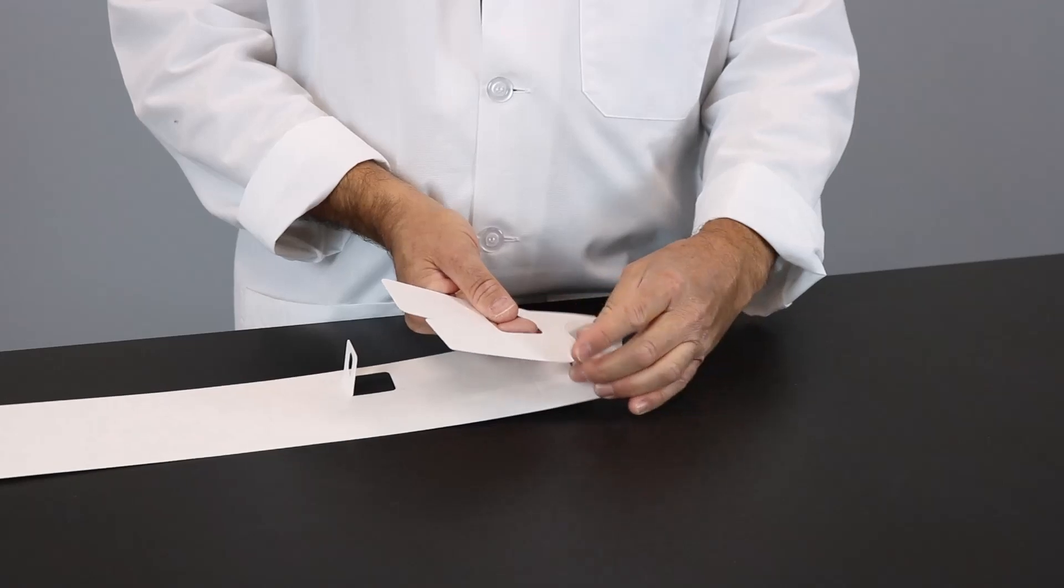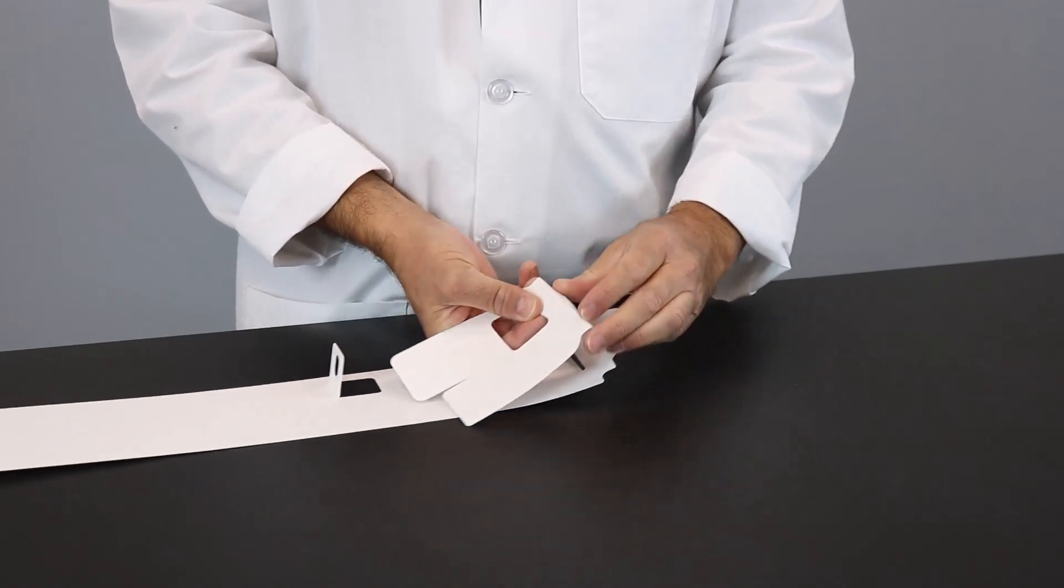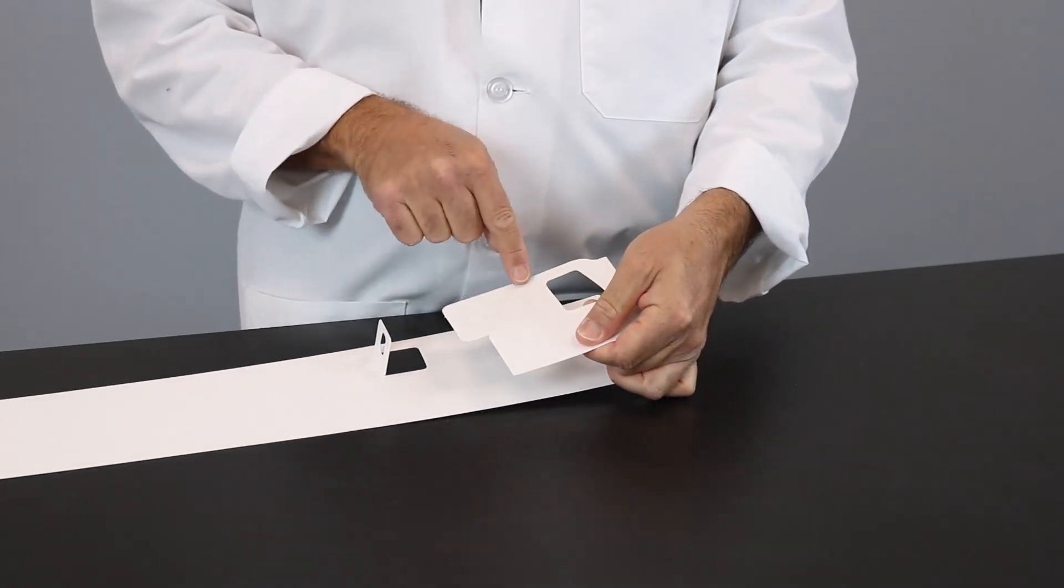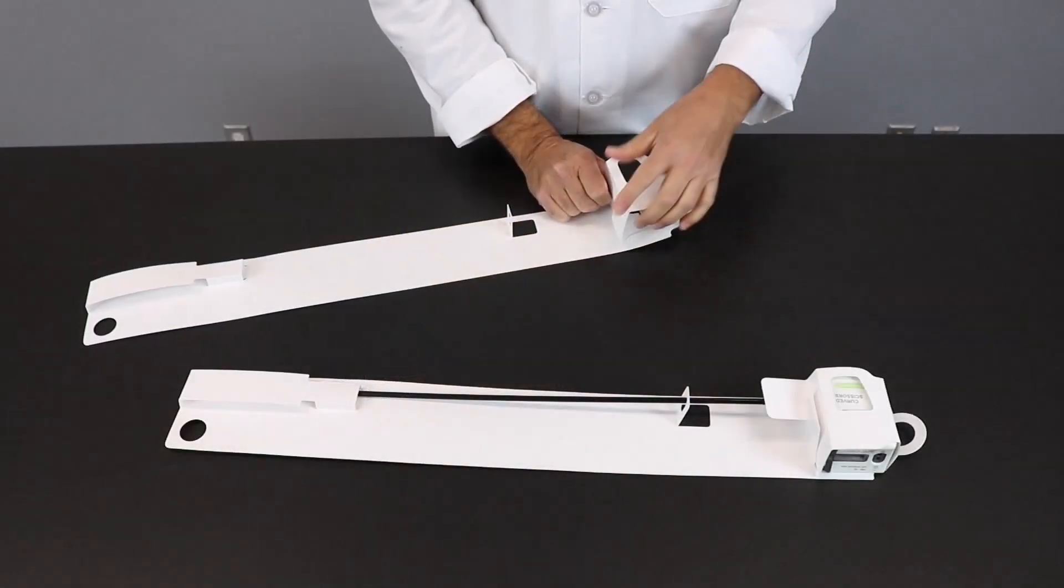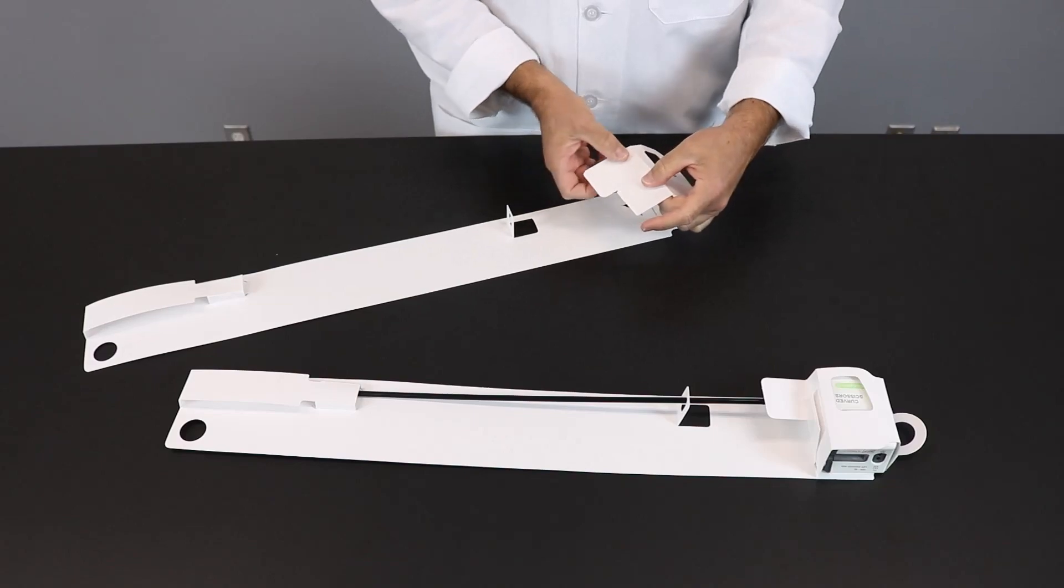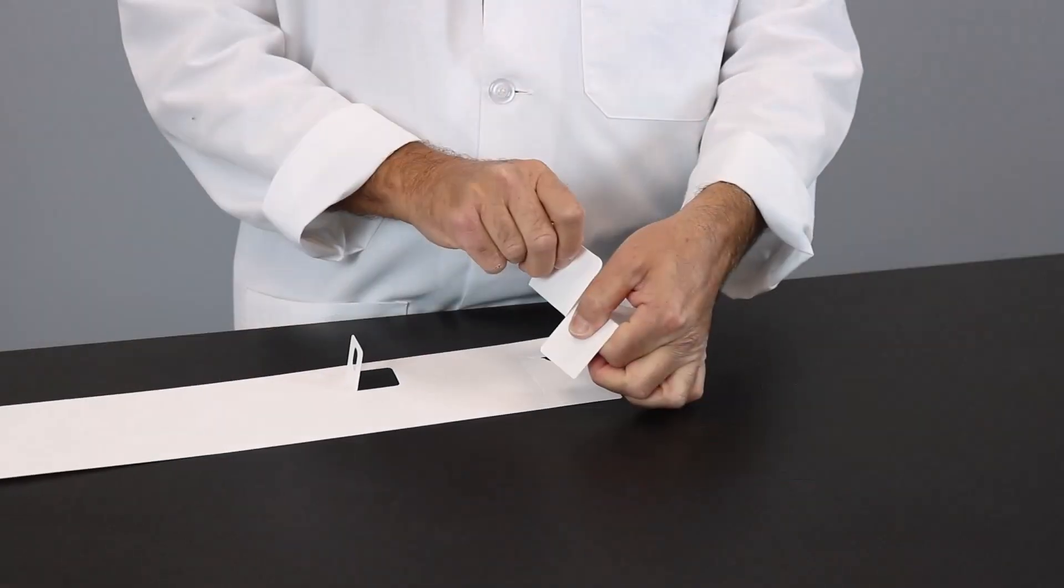Then we're going to take the housing flap and you're going to see two main creases here. So we're going to crease on that score line here, do the same for this one, and you can see it kind of forms a box. Then take this last one here in the locking tab and fold that up.